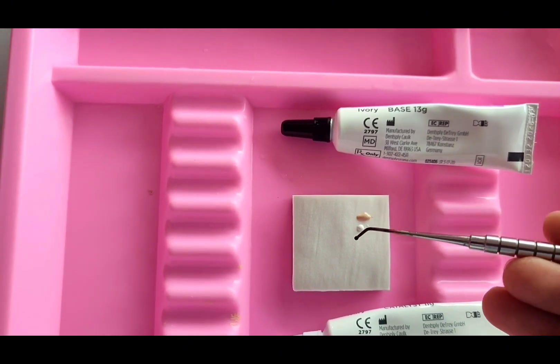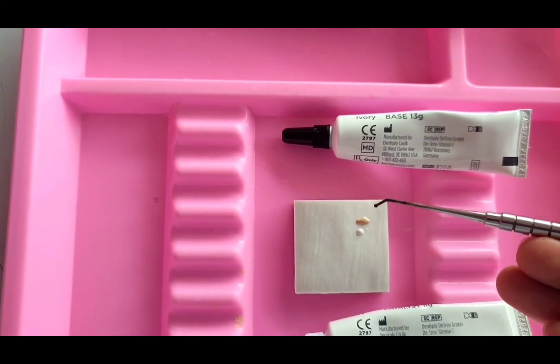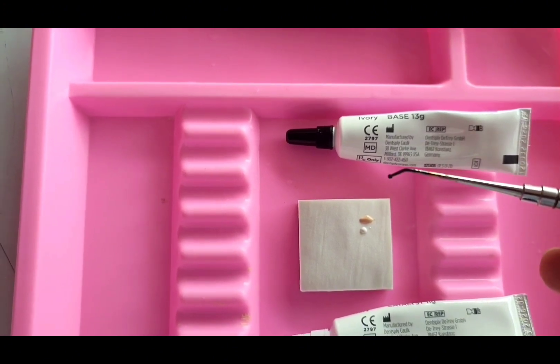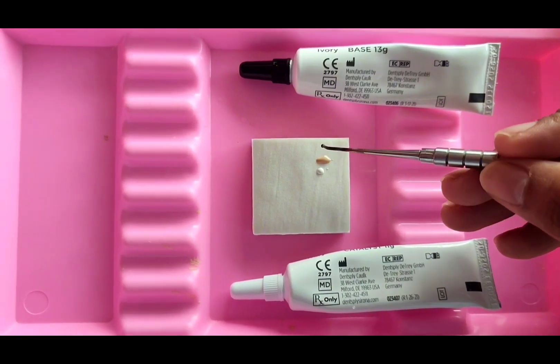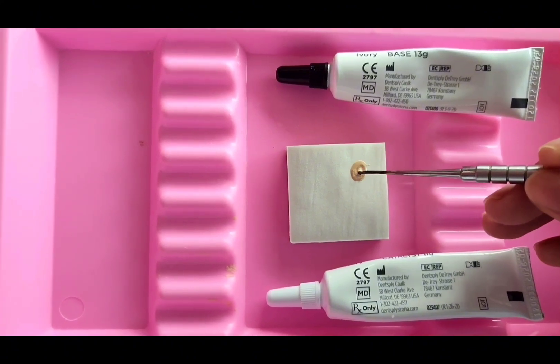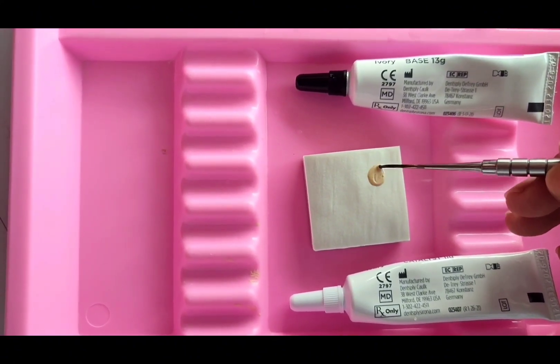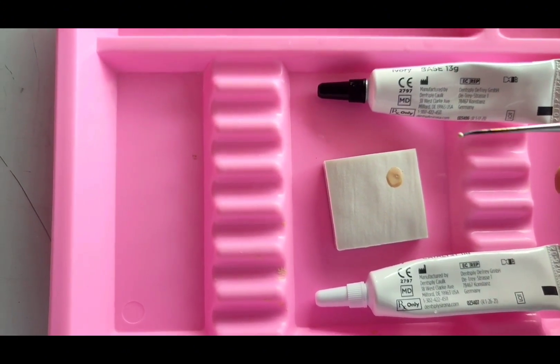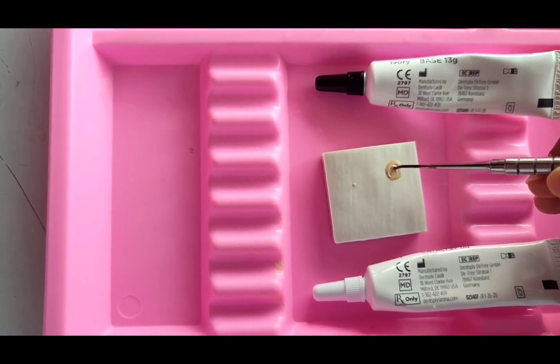Avoid use of excessively small pluggers or high packing pressure, which might cause fracture of the material and cause it to crumble. Selection of the instrument can be done based on the size of the cavity. Stir immediately to mix thoroughly until a uniform color is achieved — do not over-spatulate. Complete mixing within 10 seconds. Do not attempt to control setting time by increasing or decreasing the amount of catalyst dispensed.